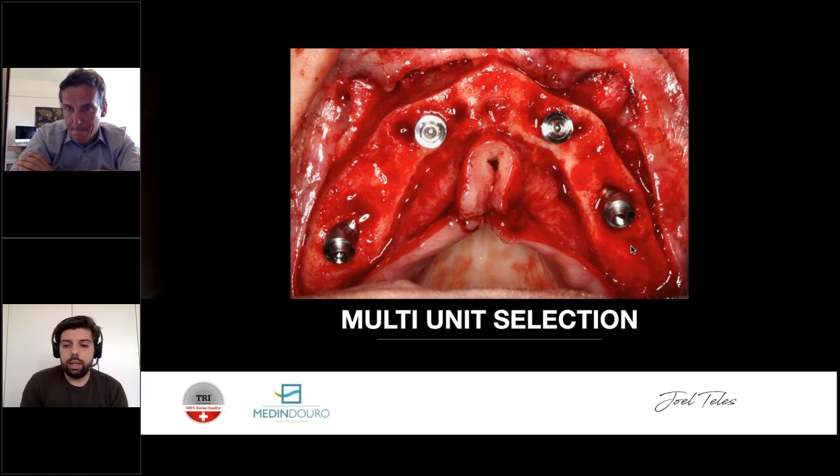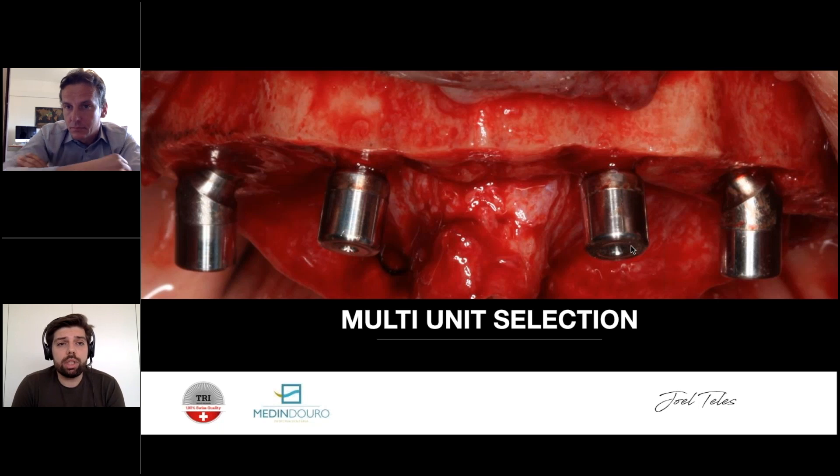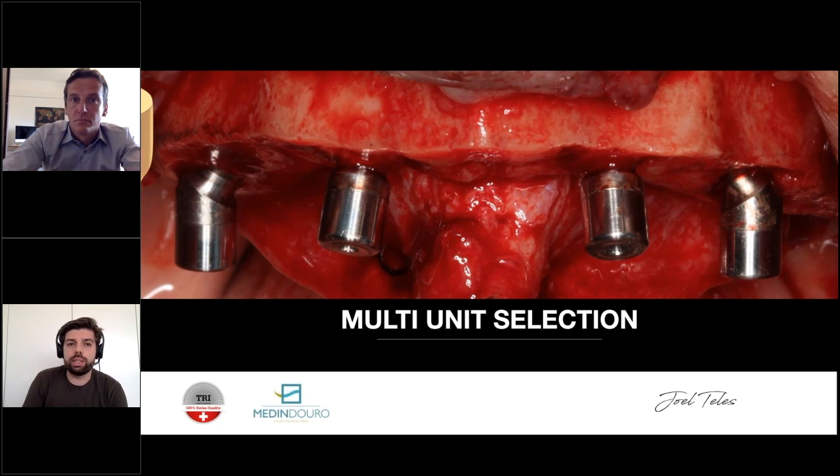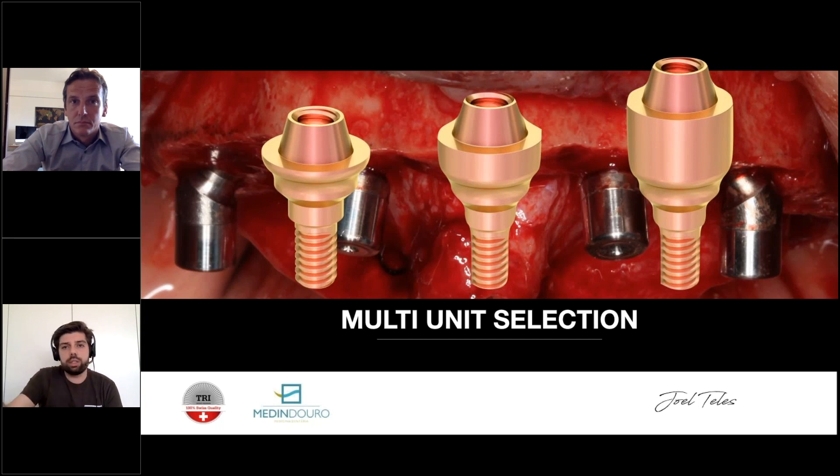In this image selecting multi-units, you can see the shelf is angulated — not flat, it's like this in the upper jaw. Regarding multi-unit height selection: I almost never use 1 mm. Normally I go for 2 mm combined with the thread-free portion of the implant — that gives a good tissue height. I almost always go for 30-degree angulated multi-units for the tilted implants.